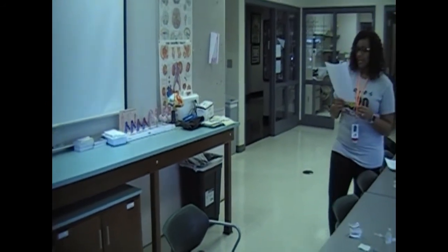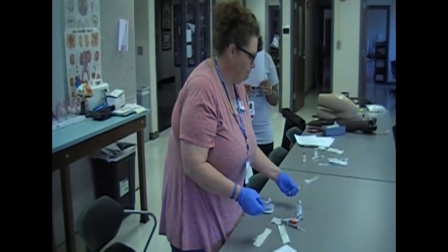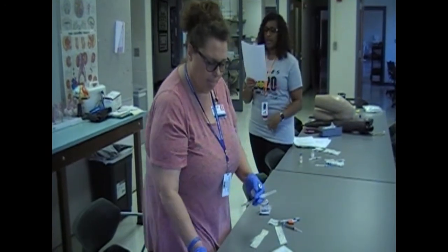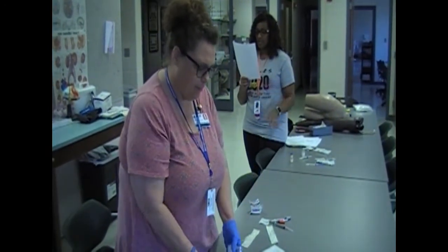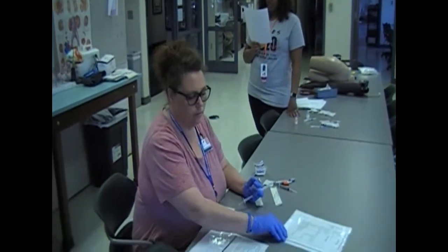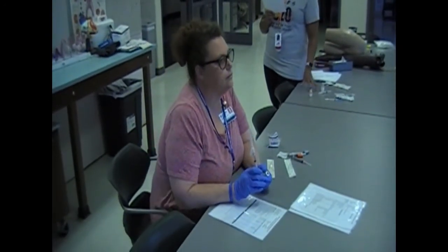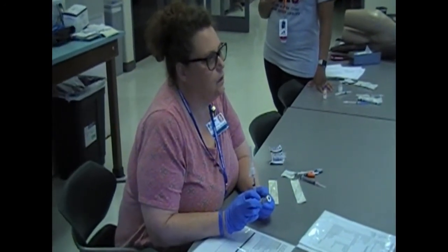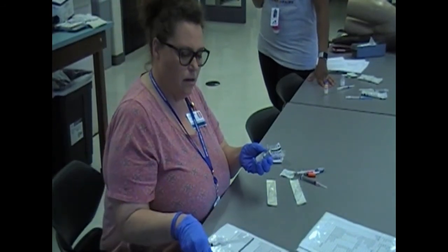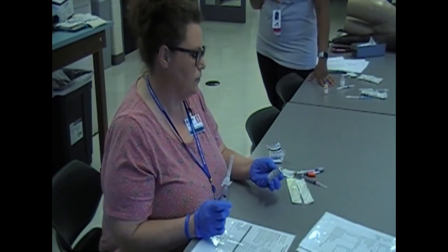Once all of your medications have been drawn up with the correct needles, then you are going to do your 3rd and final med check. So you're going to verify your meds with the MAR again, one by one. And it is helpful to say them out loud in order to prevent an error. This is the last time that you can check your medications before the meds will enter the patient's body, and you can't take it back. You have to verbalize again that the expiration dates are good.